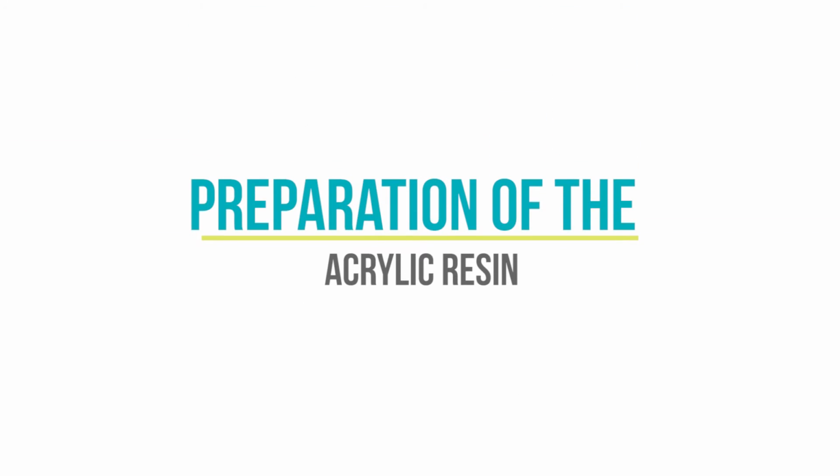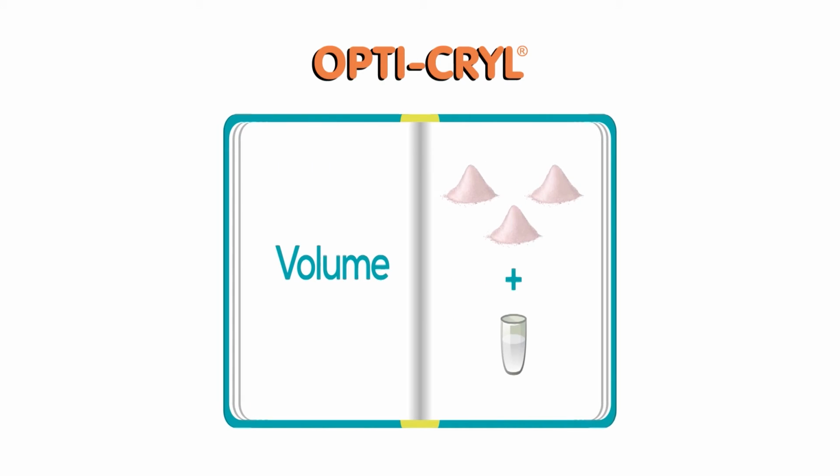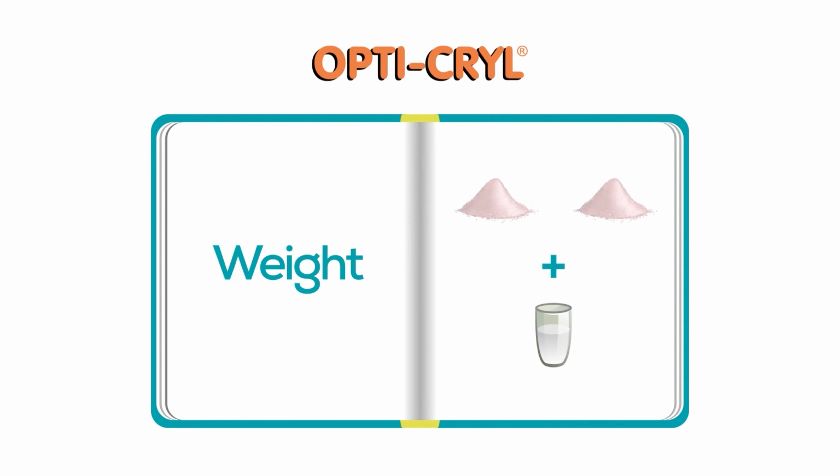Preparation of the acrylic resin. Prepare the Opti-Cryl acrylic resin according to the indications in the instructions for use. In this case, we will take 3 parts of the Opti-Cryl polymer original color in volume and 1 part of Opti-Cryl heat curing monomer in volume unit. If taken per weight, it is recommended to use 2 parts of polymer by 1 part of monomer.